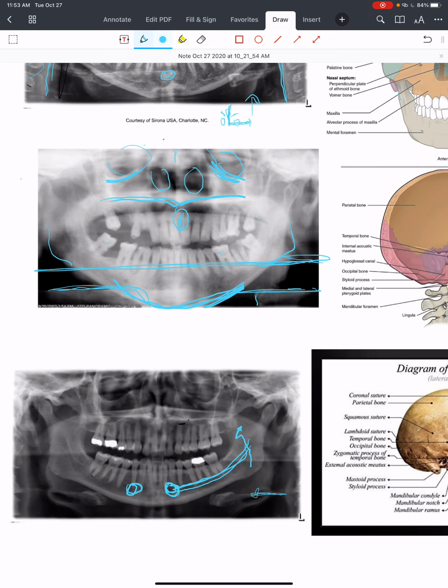Next, following the body of the mandible, just parallel here to the ramus, we see a long structure, almost like a pen shape. And I remember this structure as a stylus pen. It's going to be a radiopaque, almost crooked diagonal structure.